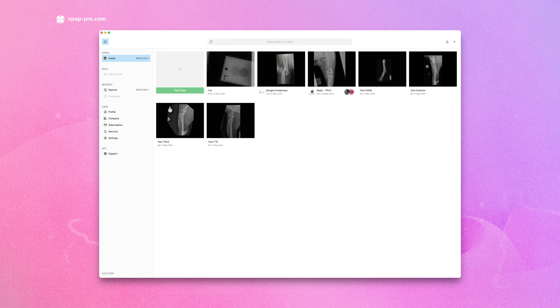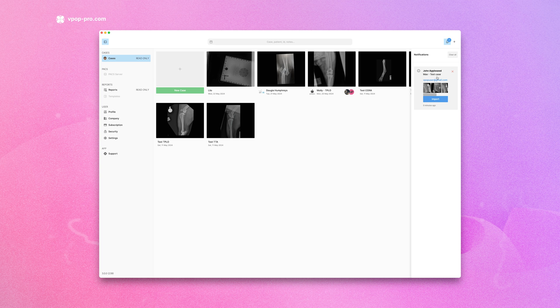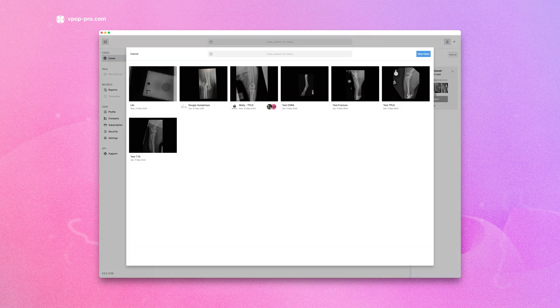Once you send the email, it will automatically create a new case in your VPOP account. Simply switch back to VPOP where you will see a notification of the incoming case. Click Import, then choose to create a new case or add to an existing one.